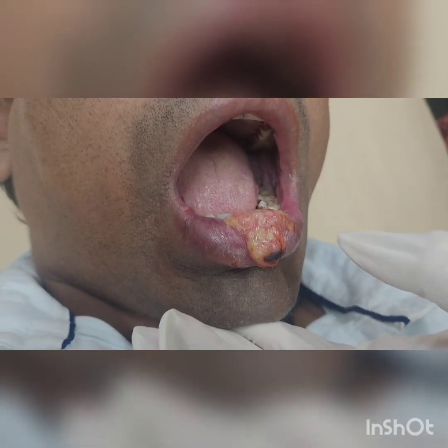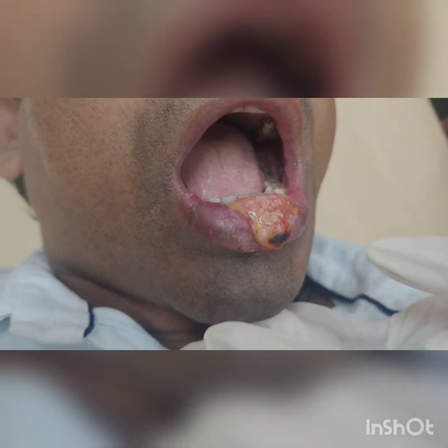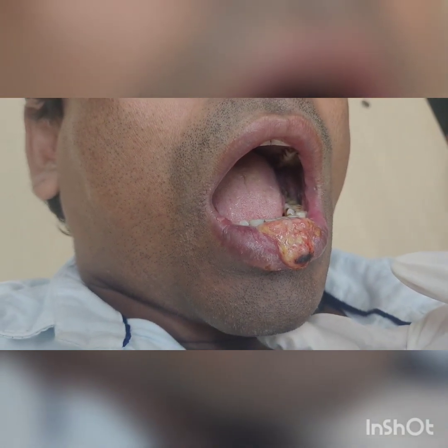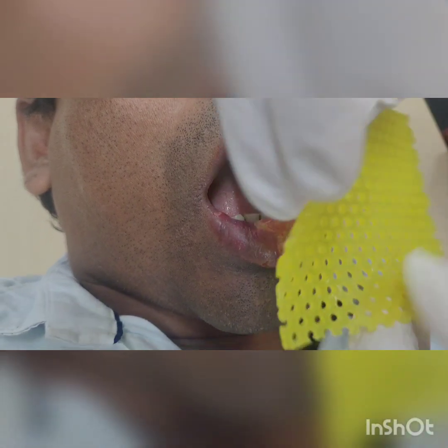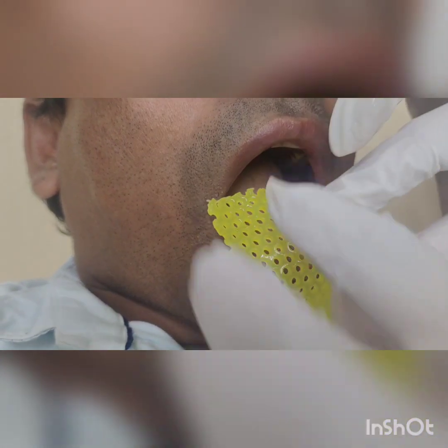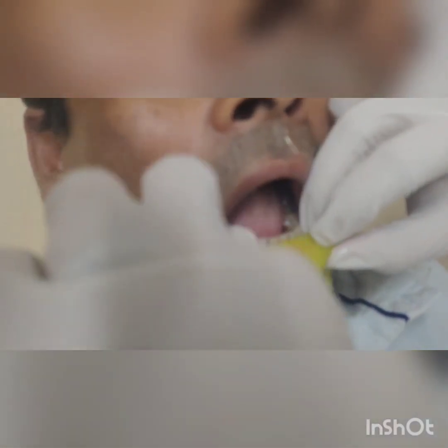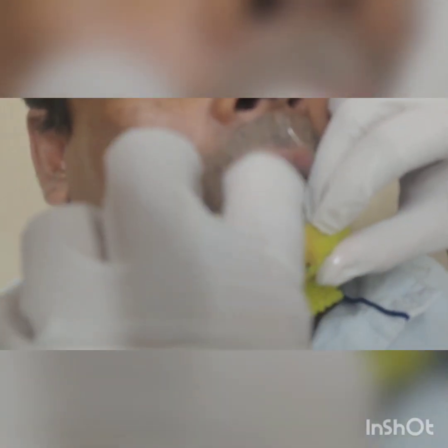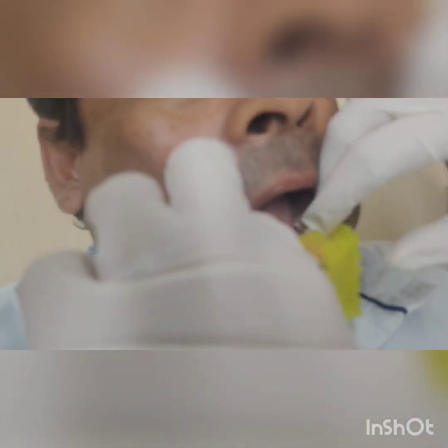This is a small plate — a small piece of thermoplastic mask, as you can see. I'm going to make it melted at 70 degrees centigrade.